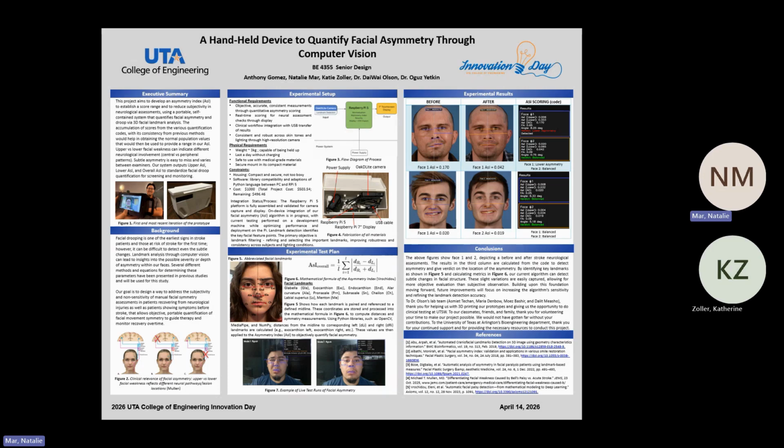These scores, with the various quantification codes from computer vision and Python and this consistency from previous methods, would help us in obtaining these normal population values.